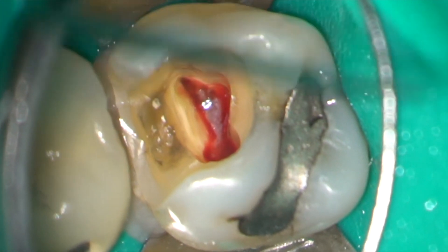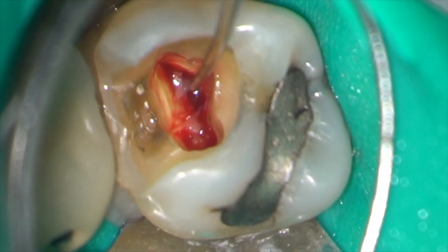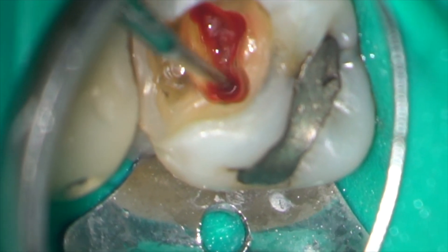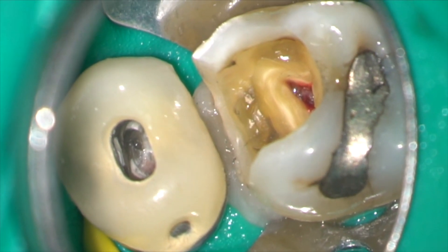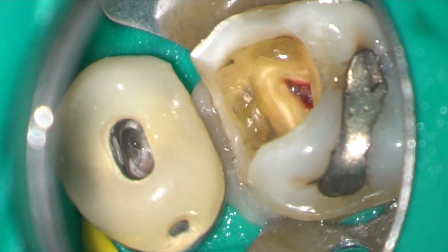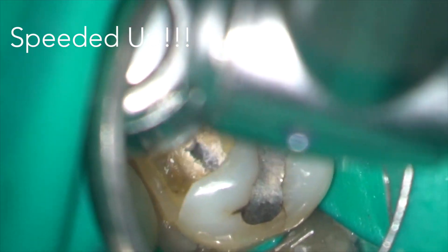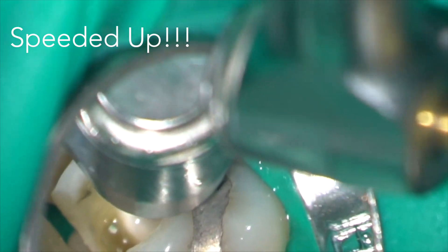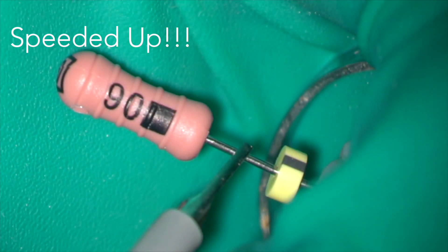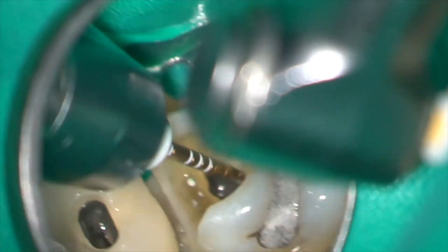This is indeed a very poorly pulp and I can lift pulp tissue out using an endoprobe. I went on to locate the four root canals in the tooth. I established a working length using an electronic apex locator, then created a glide path with a size 10 hand file. The canals were rapidly tapered using Wave One Gold instruments and then irrigated with 3% sodium hypochlorite.